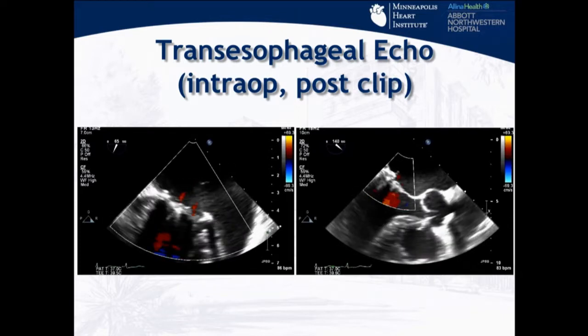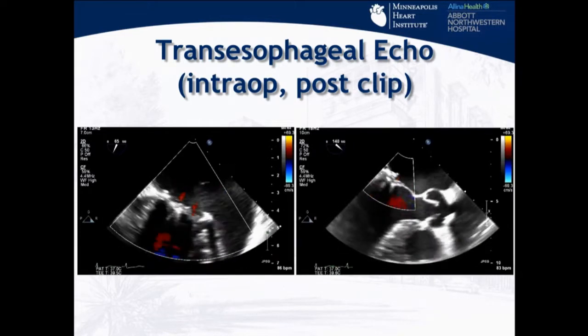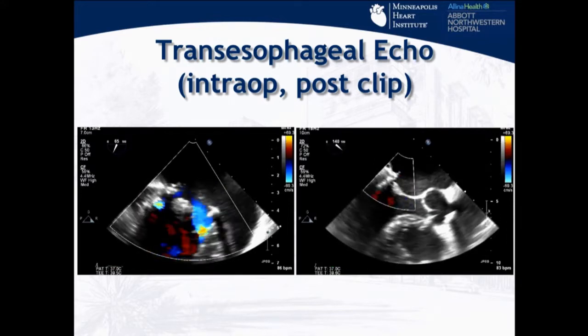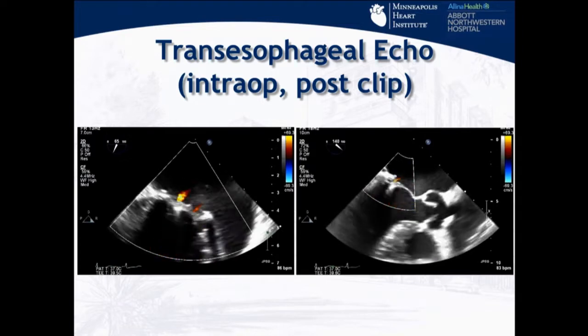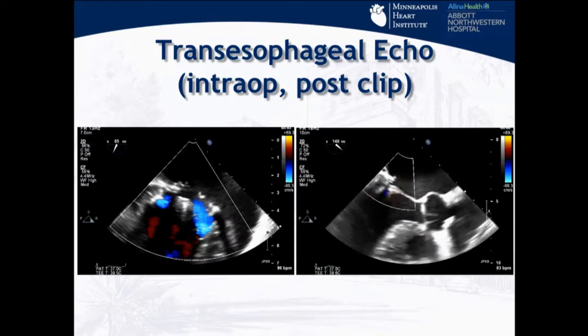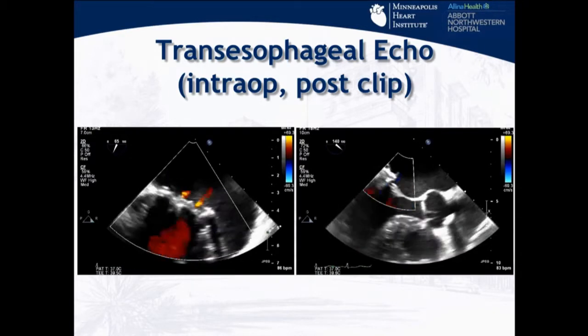And I think, I guess you agree, Paul, without that long anterior leaflet, I think we had 1 or 2 cases like this now. You probably never reach this goal. But if you have a situation like this, and if you don't have a surgeon who wants to reoperate, and if you don't have any other annuloplasty device, I think you can try if you're an experienced operator. It's really on the ring, or keep on tissue close to the ring.